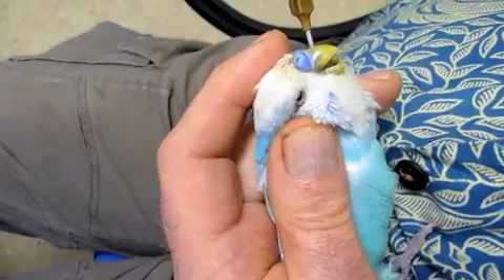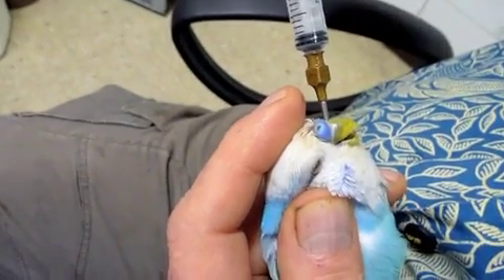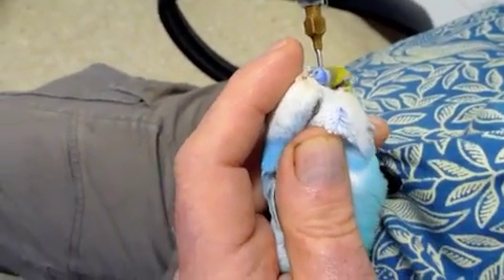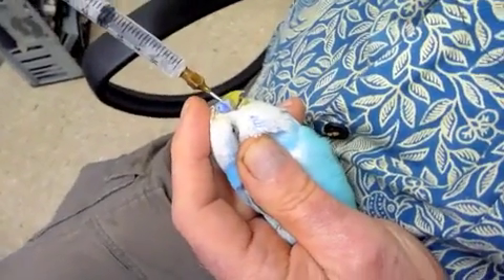I'm checking that I can feel it there, making sure that he's upright as I syringe in up to a mil of water — usually sterile water. And now I'm just taking back and forth until I get a little bit flowing back up into the syringe.